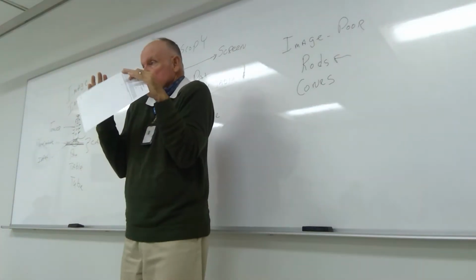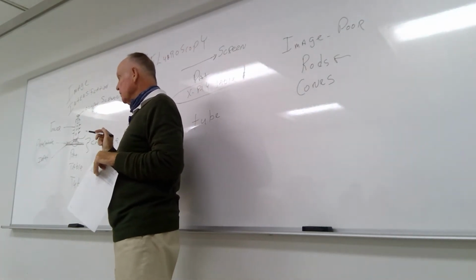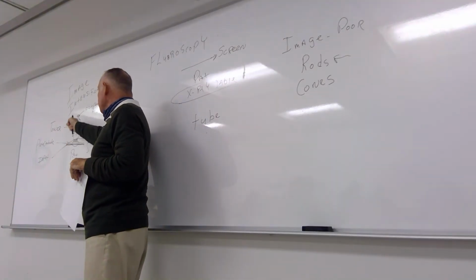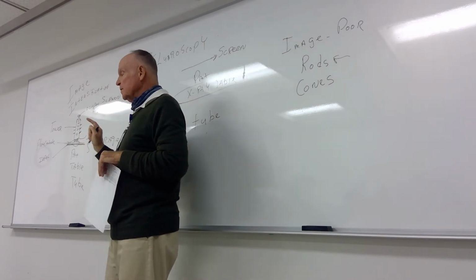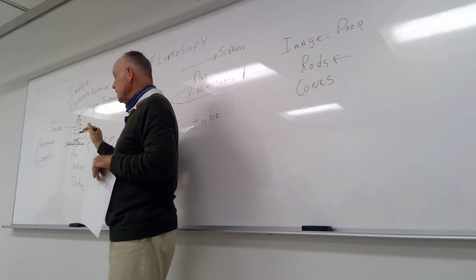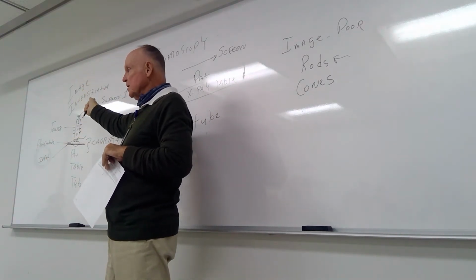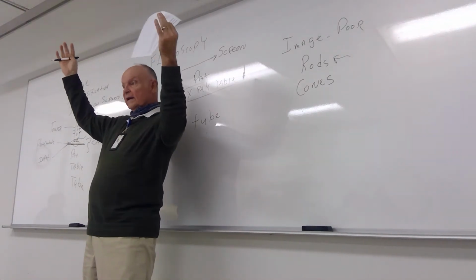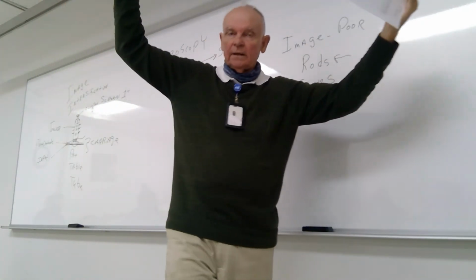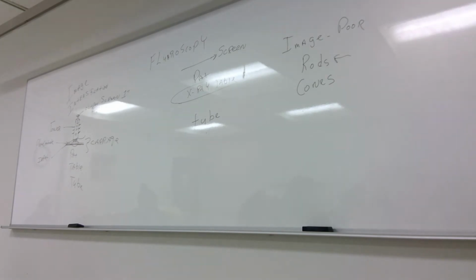They're all pushed together, and that's called minification. Going from a bigger screen to a smaller one is minification, and there's also something called flux gain. That is the fact that these electrons are shooting up, hitting that screen, making a big bright image. It's brighter. Remember I told you early on they complained that the images were too dull? They took care of it.